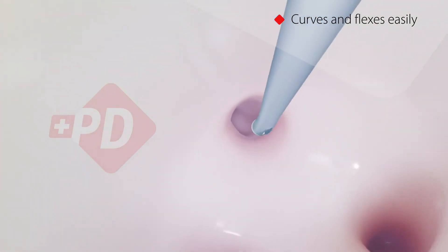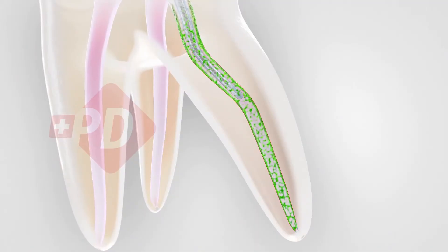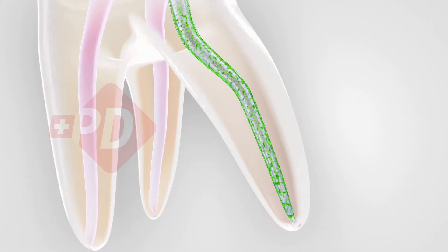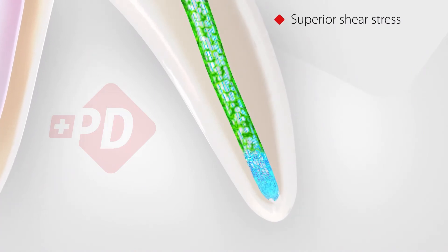If necessary, Irreflex can be slightly pre-bent before insertion. The soft polypropylene body makes the needle curve and flex easily in the most complex root canal anatomy without being traumatic for dentin. The four percent tapered shape matches root canal preparation.